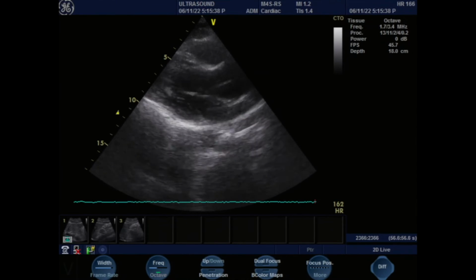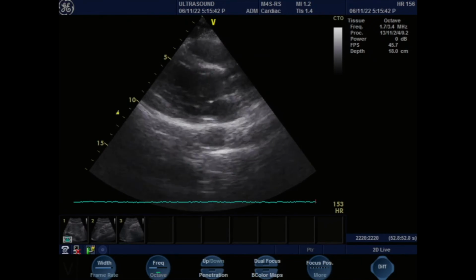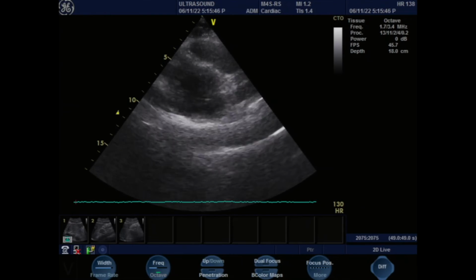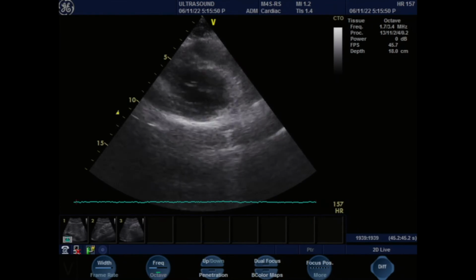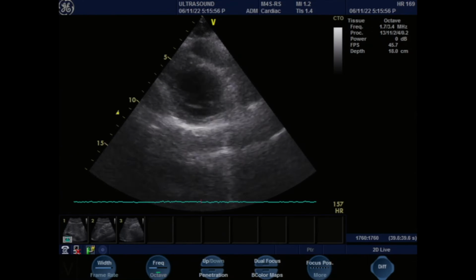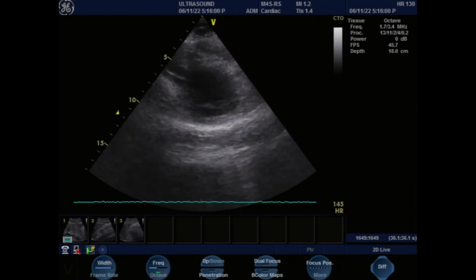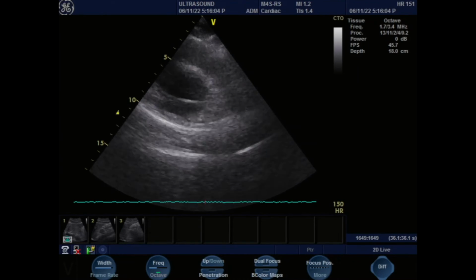Okay, and then when you turn this just a little bit like that, you can see a little more valve, and you keep on turning. Now you get a circle. See that? Now you see the mitral valve completely as a full circle right there, opening and closing. Now, if you have rheumatic mitral disease, it would be very small and would not be opening properly. Okay? And then if you just keep on going like this, just in the same place.